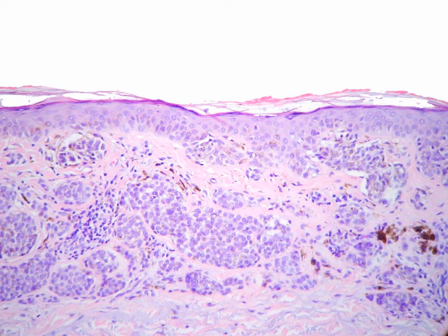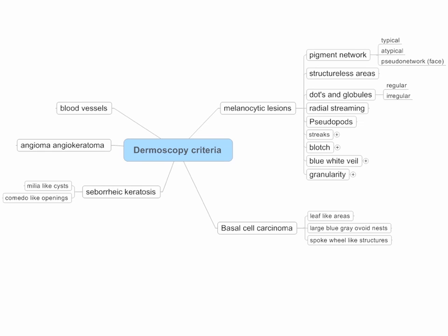Histopathologically, blue-gray means melanin pigment in the dermis, and usually this is in melanophages within the dermis, as seen here. In this podcast, we covered the melanocytic lesion structures and their histopathologic correlations.